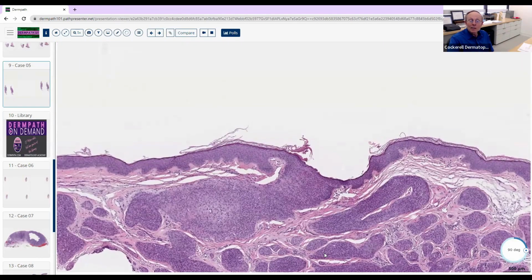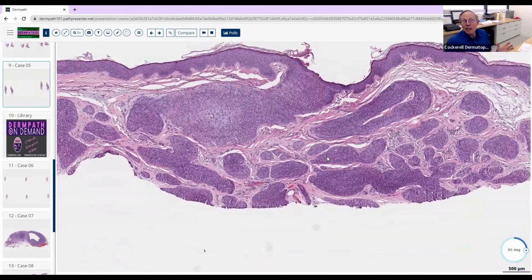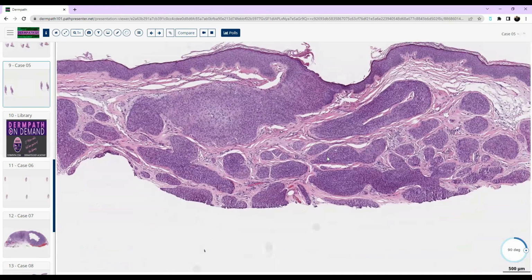So what are the entities that give you the poroid differentiation? Yeah, so the types of poroma: there's the eccrine poroma, hidroacanthoma simplex, the dermal duct tumor, and the nodular hidradenoma. Yeah, the poroid hidradenoma. Good, that's it. Perfect. And then, of course, the malignant counterparts of those. So of those few, which one do you favor the most? I think I would favor an eccrine poroma. There's a dermal component, and it looks like part of it also connects to the epidermis. Not this one area here, yeah.